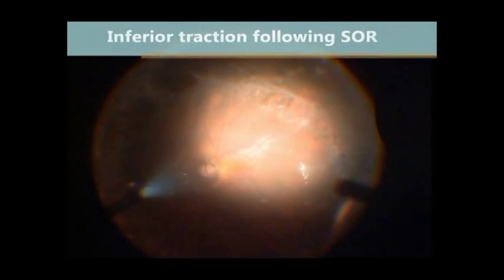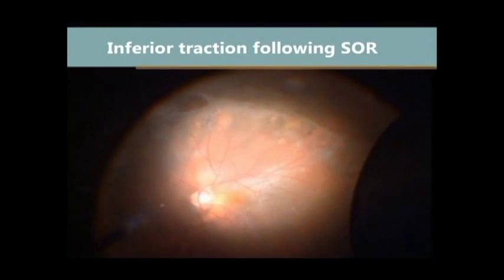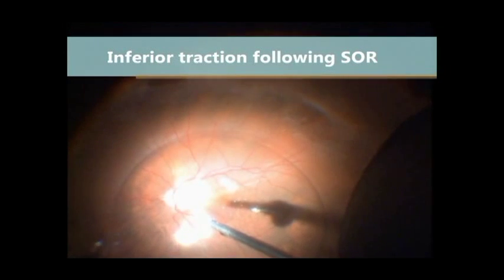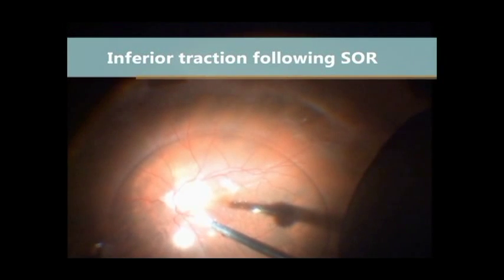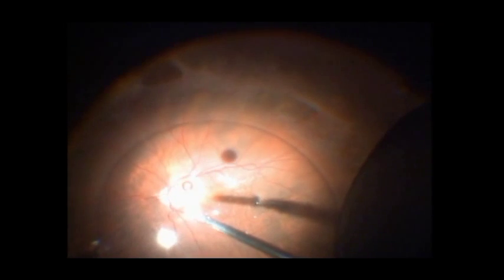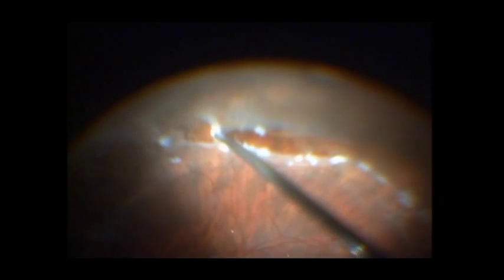Air-PFCL exchange is done, ensuring that the edges of the retinectomy remain dry. After this, silicon oil is injected. This is a case of sub-silicon oil redetachment with stiff inferior retina. PFCL is injected to flatten the retina. Preparatory endo diathermy is done, followed by retinectomy to relax the stiff areas.